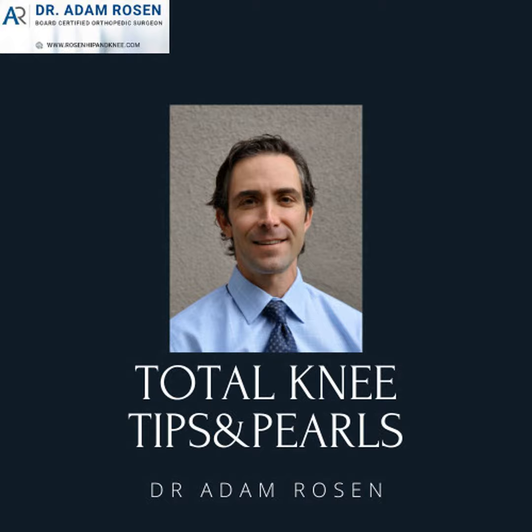And I think people are more fearful of the femur and the acetabulum and the hip than the knee. I think people think, well, I'll just open up, see what I got, and I'll just throw some augments and cones. But it is good to have that plan because you don't want to get caught with your pants down and think, oh, I just got a revision, it's a loose implant, and then get in there and find out you needed a hinge, or it was so weak that just in retraction you broke something off, or getting the implant out, you broke it off, and now you need a DFR.